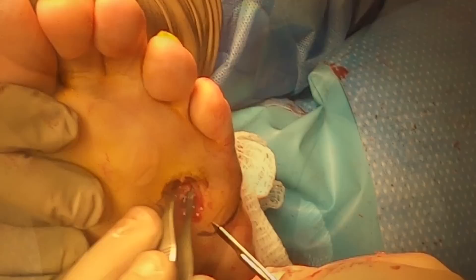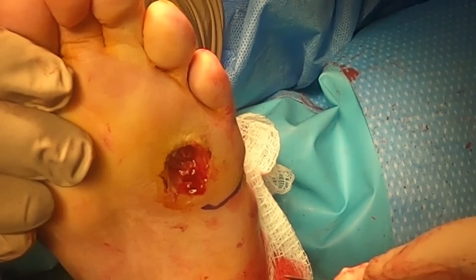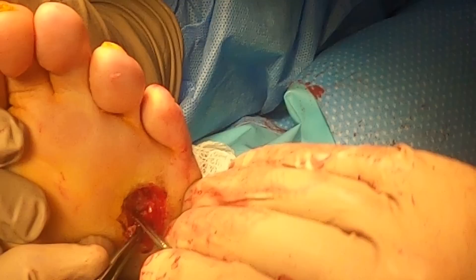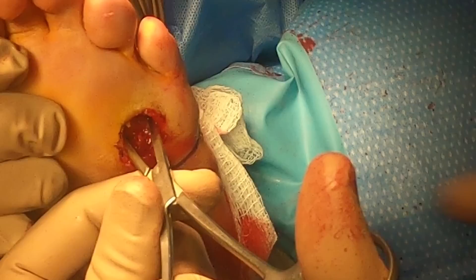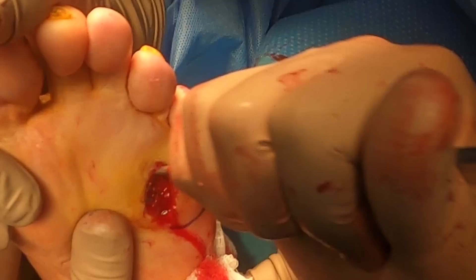The goal right now is to loosen up as much soft tissue around that bone so that it could be freed up and essentially removed, hopefully in one whole piece. I'm trying to loosen up that head of that metatarsal. I tried to take a hemostat just to pull it out, but it's not working — I ended up bending those hemostats and had to apologize for ruining a piece of surgical equipment. So I'm trying to take a key elevator and really free up as much of that bone as possible.